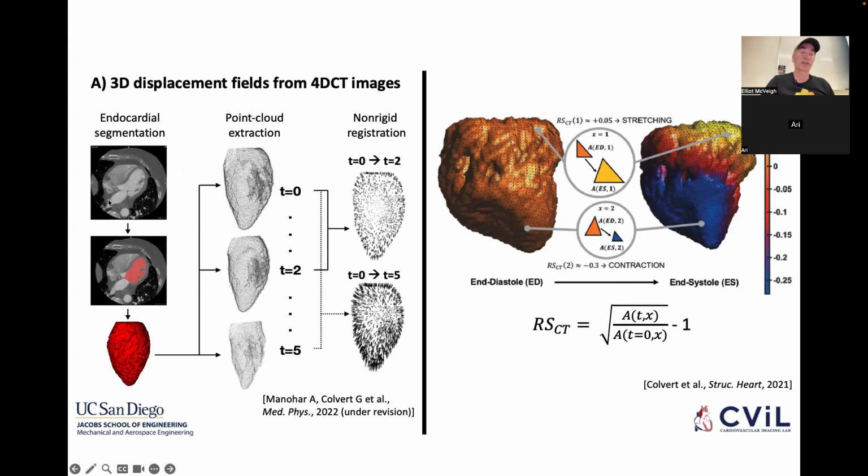Because this step here had been an open problem since I started in medical imaging, which was in the 80s. People had all these ways to do segmentation and there's like 1,000 papers written on how to segment stuff. None of it works automatically. They all claim, oh, it's semi-automatic, it's this, it's that. None of it worked until recently with deep learning. Now it seems to be working. So it's a huge step, right? Now that all this automatic stuff will be done, it's a huge step.